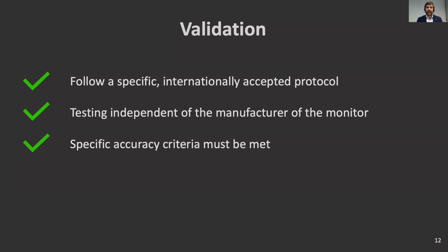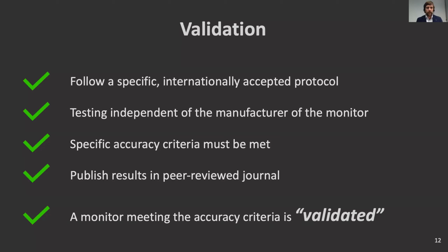The specific accuracy criteria that are set out by the protocol must be met or exceeded. Ideally, the results will be published in a peer-reviewed journal. And finally, a monitor that meets all these accuracy criteria is said to be validated. So when I'm talking about validated blood pressure devices, that's what I mean. These devices have gone through this process.